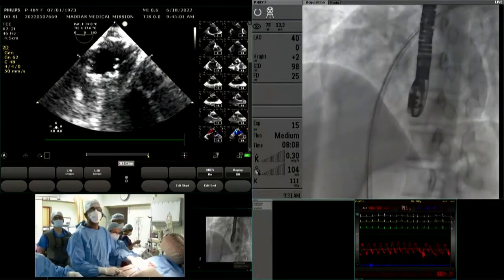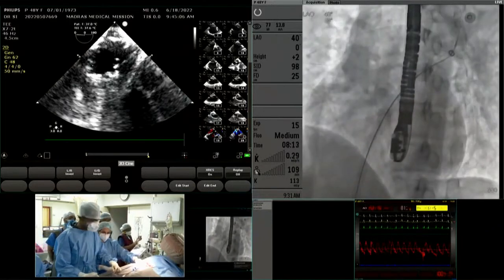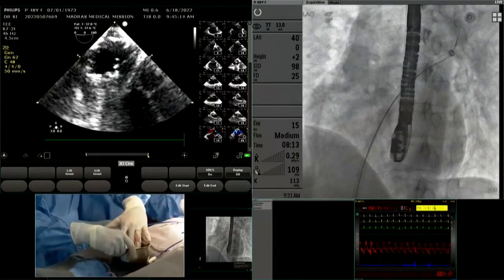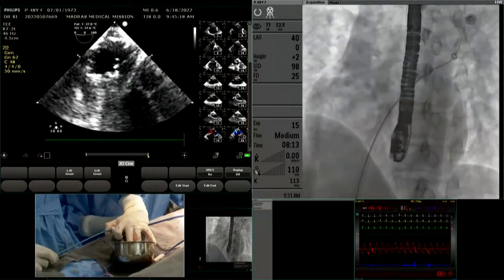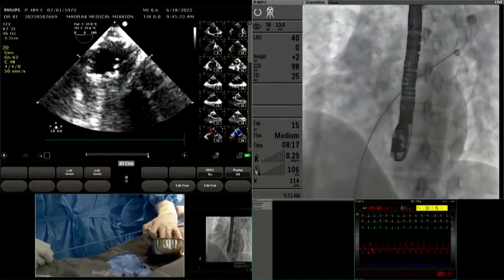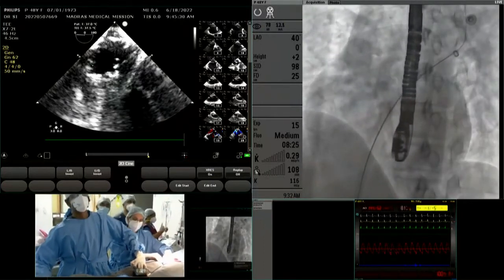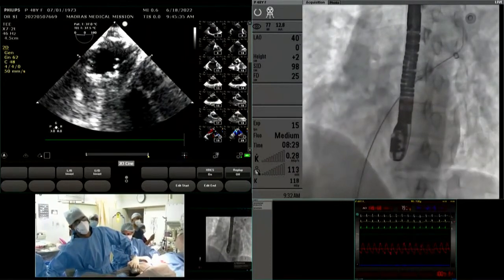Very quick point, do you routinely use the braided sheaths or do you use Cook's Mullins sheath as well sometimes? Quite a lot of time we will use a Cook Mullins sheath. Quite a lot of means maybe 90% of the time. Sir, Bhavik here. I had a question, sizing balloon, are you advancing through the sheath or directly through the groin without the sheath? Through the sheath. It was a 10 French short sheath, which 10 French we will be using as the loader finally.